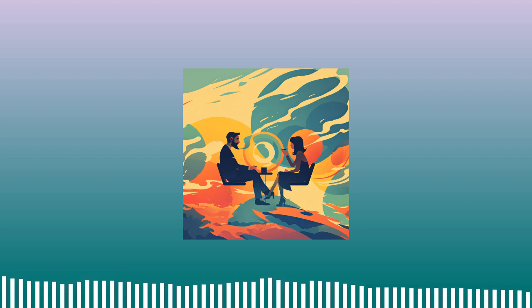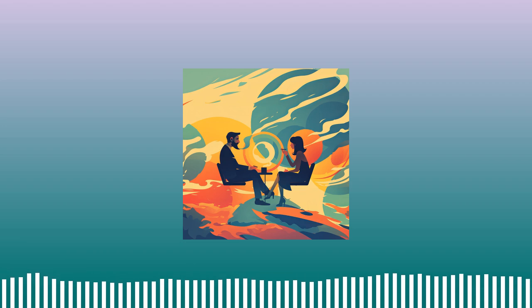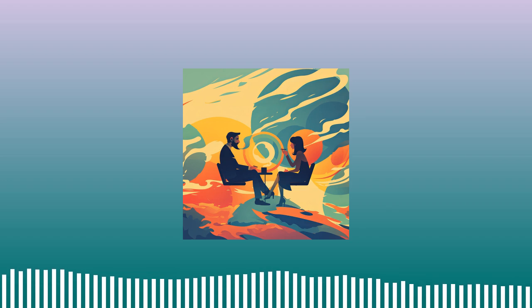And these are caused by things like blood residue or gas bubbles that get in the way of the light beam. So basically they cast a shadow in the image, and that shadow can make it really hard to see what's going on underneath. There are other types of artifacts, like guide wire artifacts, which are caused by the wire that they use to insert the OCT catheter. But this paper is specifically looking at these attenuation artifacts, which are a particularly challenging problem.